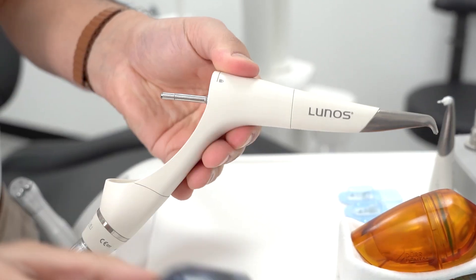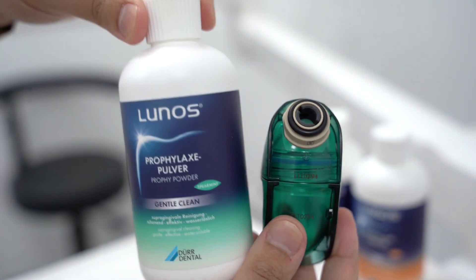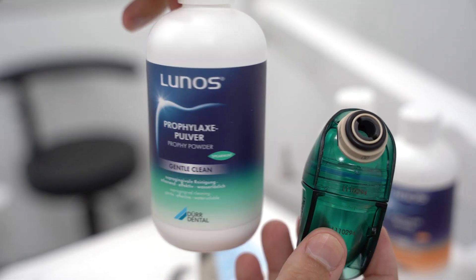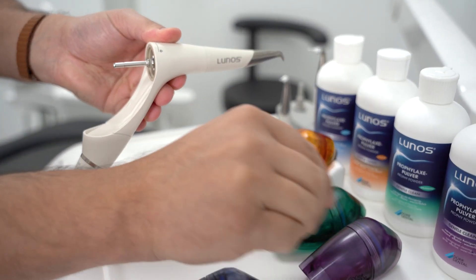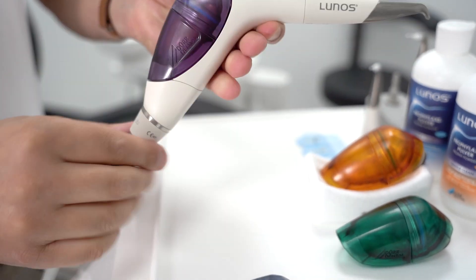The chambers are available in a range of colours and can be easily colour coded to allow easy identification between different flavours or different types of powders. Being able to remove the chamber from the body, you can easily swap out the pre-filled chamber mid-appointment if needed, or easily swap between supra and subgingival powders.